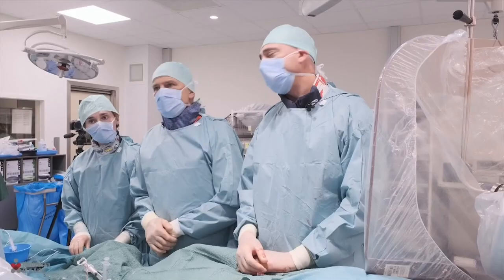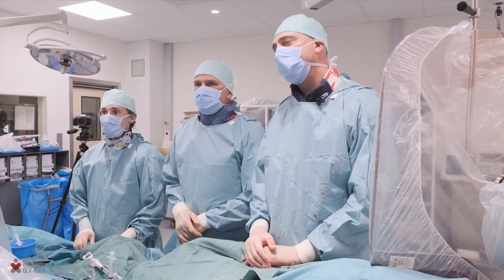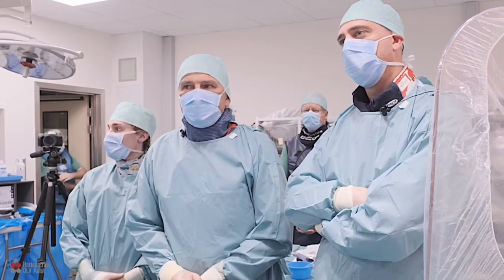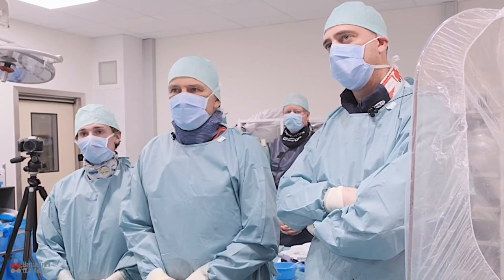Also, the post-PCI FFR is very reassuring, with a value of 0.88. I think with all the data we have, we expect both angiographically and hemodynamically a good result on the longer term. So thank you, Jeroen. It was a nice demonstration of a complete functional revascularization of a young patient, very physically active still, based on the fractional flow reserve measurements and pullback of these pressure measurements.